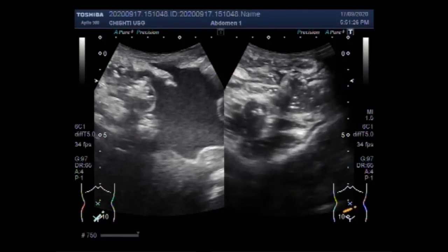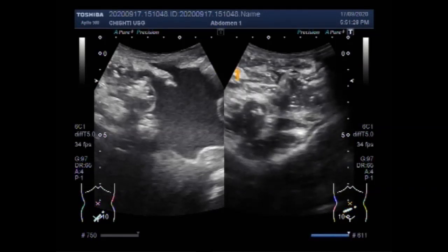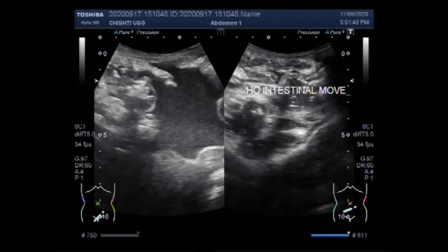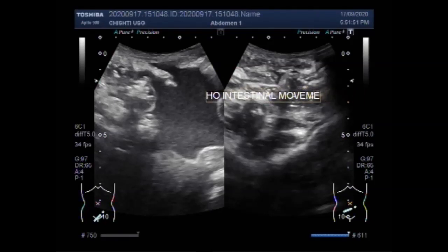Now you can see the gut loops in the middle abdominal cavity, and there is no intestinal movement. The gut loops have no intestinal motility — the gut movements are missing.